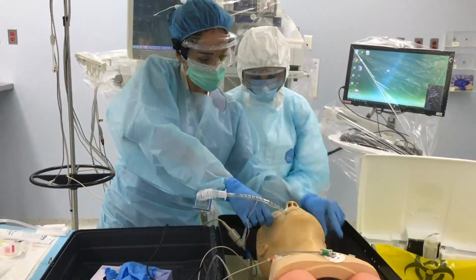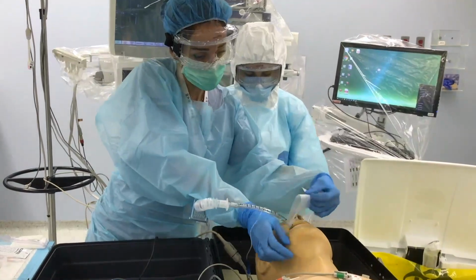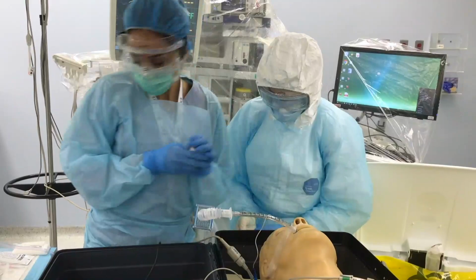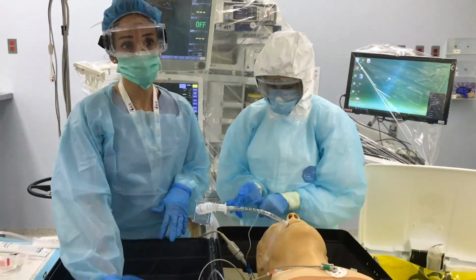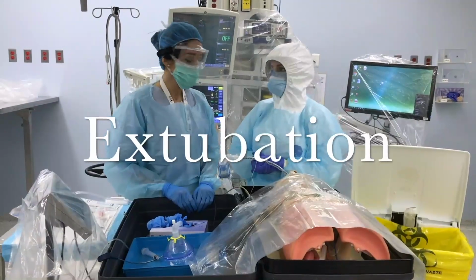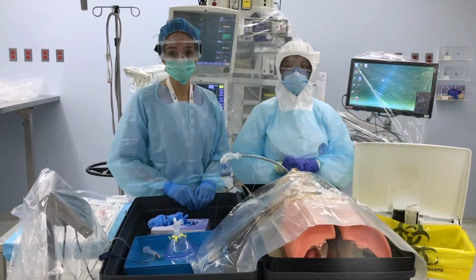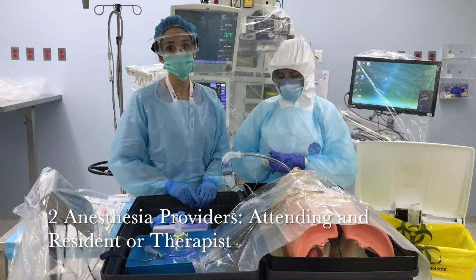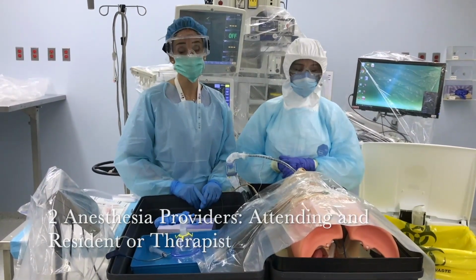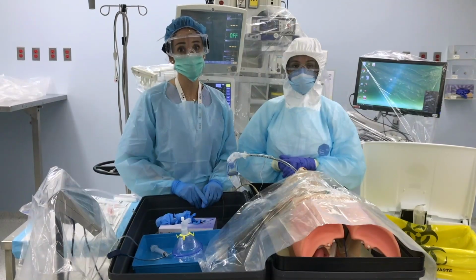Now we might ask the rest of the personnel to step in the room if they have to. All the contaminated equipment shall stay in that bin for disposal. So now that we're ready to extubate, we're going to ask everyone to step out of the room. Only the anesthesia attending and the anesthesia resident are going to be present for that step. Again, remember, they should be both wearing full personal protective equipment.